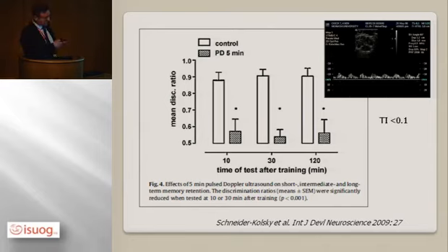And we should especially be thinking about that because the TI in those examinations was less than 0.1, a tenth of that we suggest in human studies. Now, I'm not suggesting that chicks and rat livers are translatable to humans, but what I am saying is that we just need to think about this.